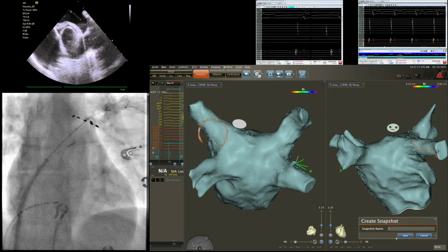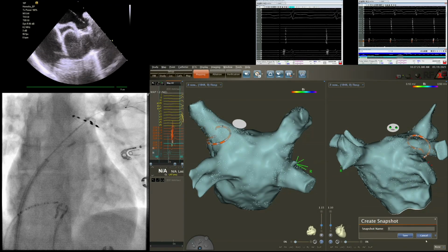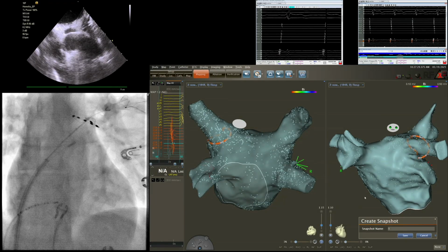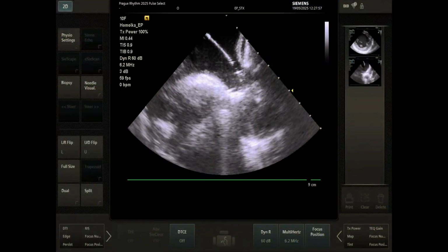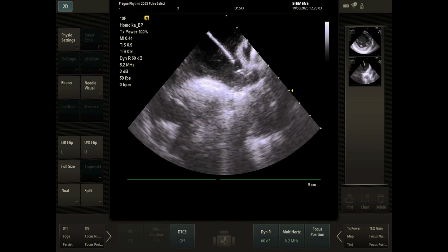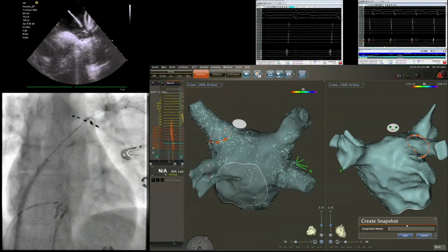Okay, so we are probably ready now for the first application. Actually, look at the ICE. We can be focused on the ICE for the bubble and the microbubble formation. And now, please, we can charge the system. And we are ready, we have anesthesia, I didn't mention, so we have anesthesia, and now it's pulsing.